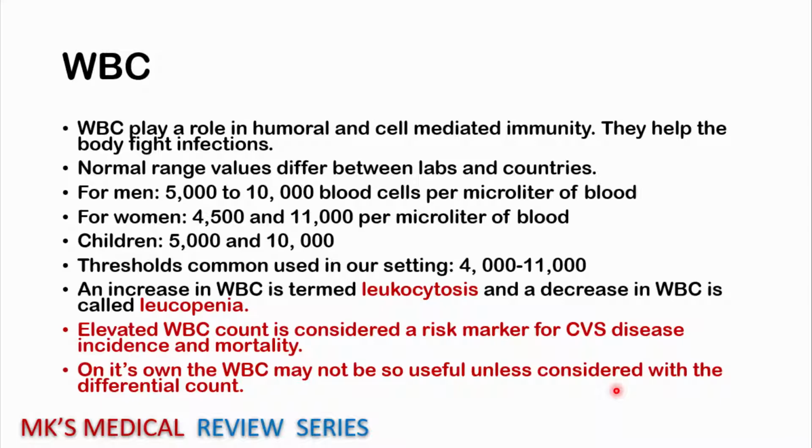And the mistake that most healthcare workers and most medical students usually make when interpreting a hemogram is that they usually only take a few of the parameters instead of looking at all the parameters and considering the hemogram as a whole. For example, the parameters that people go for are the HB, the RBC, the WBC, the platelet, and of course the MCV and MCHC. But there are other ratios and other indices present in the hemogram that are going to point you towards certain diagnoses and may actually give you the diagnosis before you carry out any other tests to confirm.